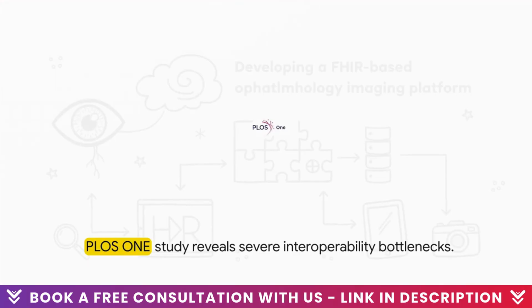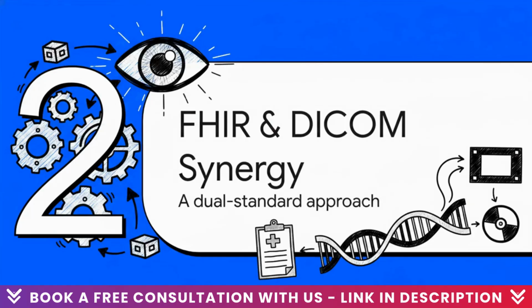There's a recent PLOS One paper that hits the nail right on the head regarding these interoperability hurdles. It points out that mapping messy DICOM metadata to clean FHIR structures is a massive bottleneck. The big takeaway here? Just having standards isn't a magic wand. Standardizing completely falls apart if you don't have a solid overarching architecture and strong governance for things like authorization and data provenance. Which brings us seamlessly to part 2, synergizing FHIR and DICOM.